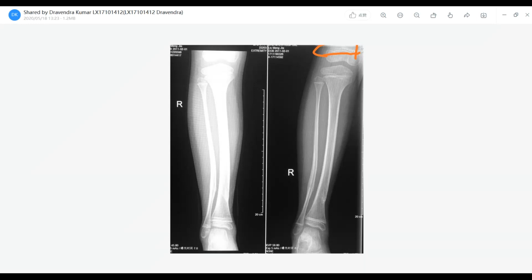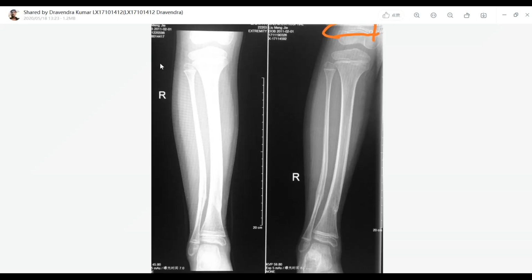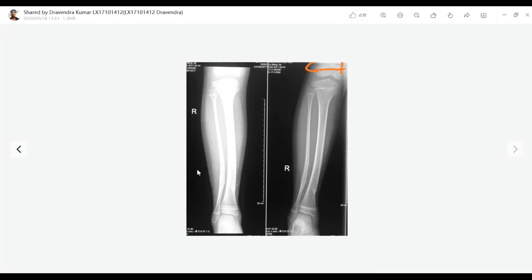It's true. But why can't I look at it here? Actually, this X-ray does not include the patella because I have only taken the AP view. But the problem here is this is both the AP view and the previous films. I am comparing, this is before, this is after, and both views are the same. I am comparing here for the fracture healing.